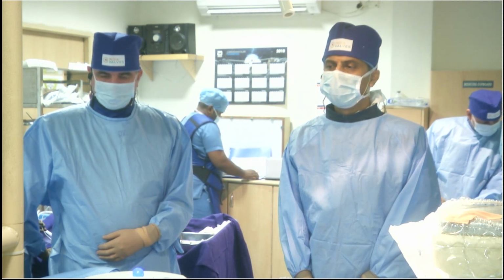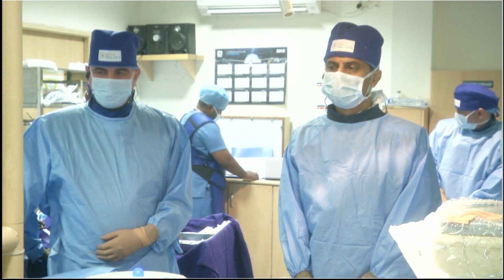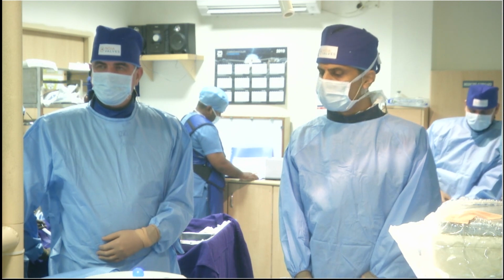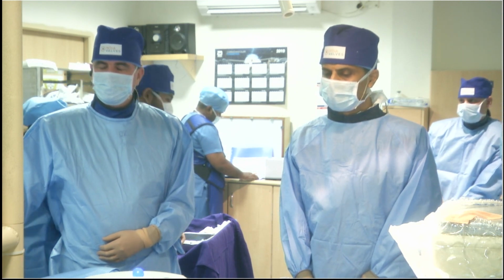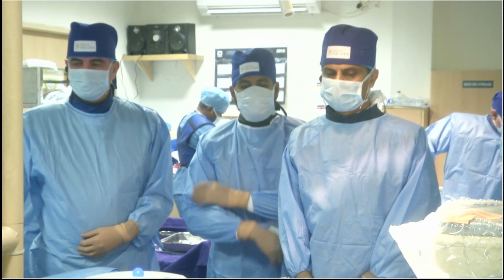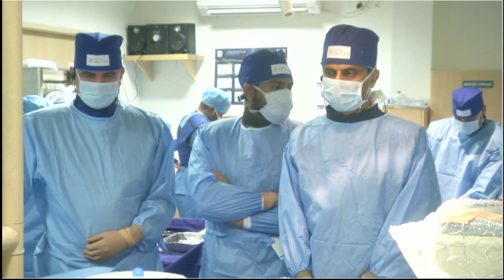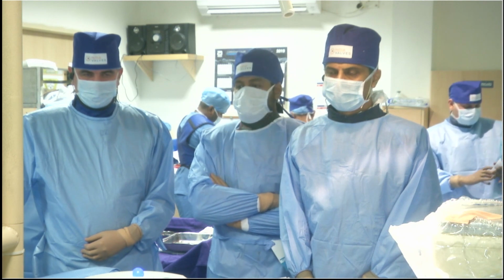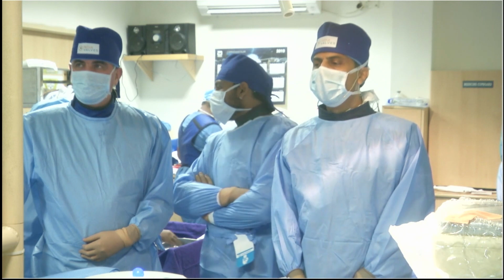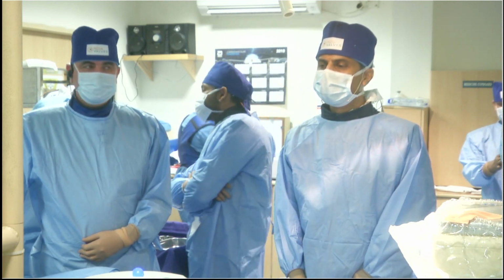These are the size lineup of the Myval: 20, 23, 26, 29, as well as the SAPIEN 3. They also have the intermediate sizes, 21.5, 24.5, 27.5, and 32 at largest. The CT also demonstrated the height of the coronary arteries. The LCA is 12, and the right coronary height is 16. The height of the ST junction is 20 millimeters.